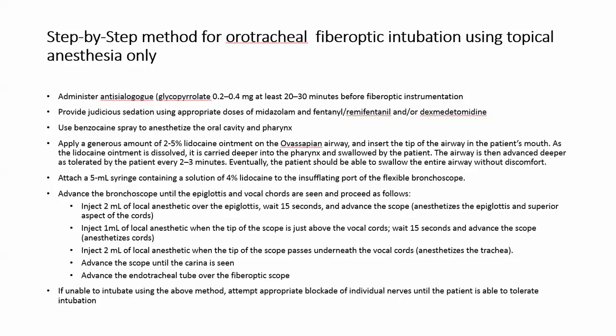This is a step-by-step summary of the orotracheal fiber-optic intubation using topical anesthesia only. Once the airway has been cleared of all the secretions using glycopyrrolate, 0.2 to 0.4 milligrams, at least 20 to 30 minutes before the fiber-optic instrumentation, judicious sedation is provided and the dosage is titrated depending on the patient's comorbidities.